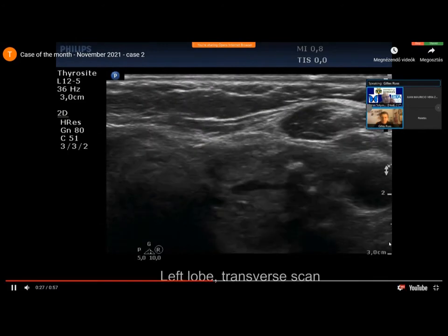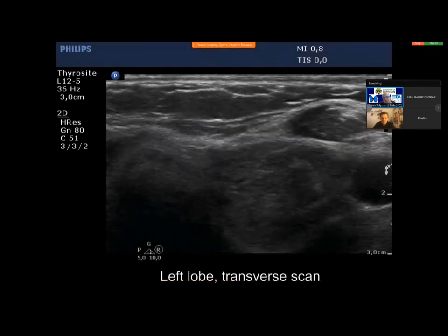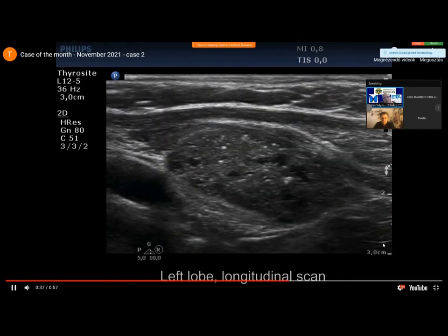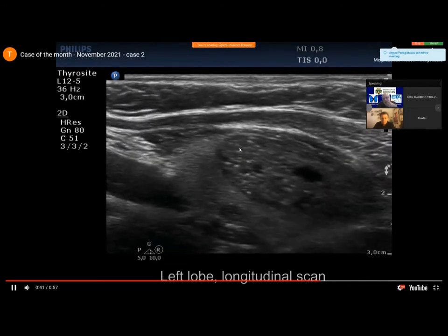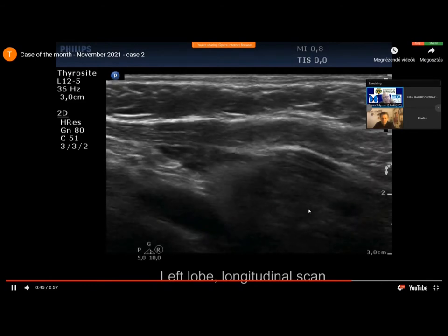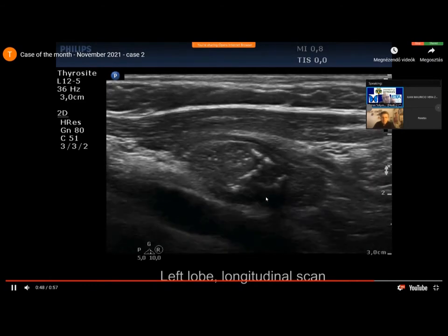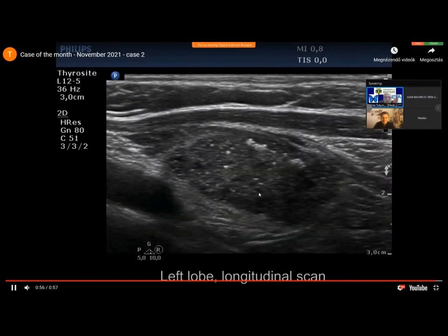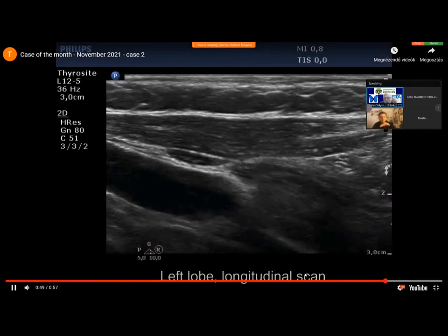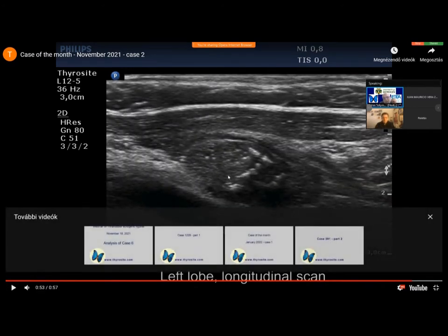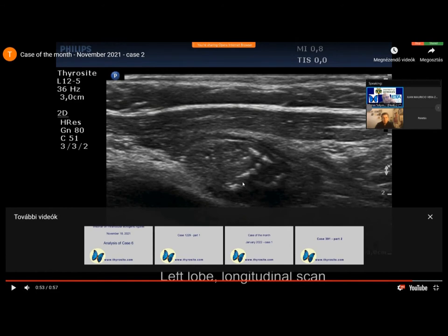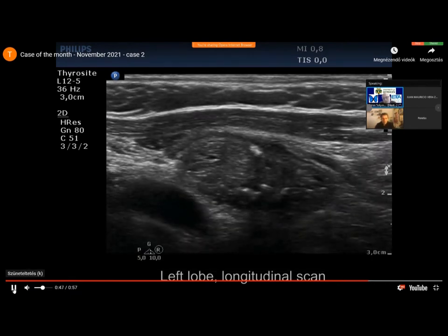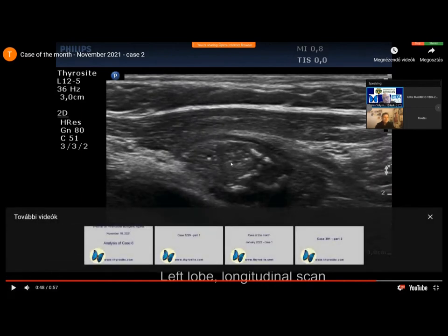The question was: what is the dominant intranodular echogenic figure in this nodule? I think that most of these granules and lines are backward cystic figures caused by posterior enhancement. About some granules, it is probably — for example here — that it can be either microcalcification, this complex structure. But the dominant one, I think, is backward cystic figures. Most of them are related dorsal to tiny cystic areas.